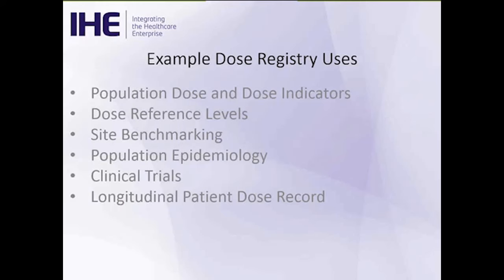So hot lab managers have been recording patient dose for a number of years, but that information has always been contained in the hot lab, and the REM-NM profile now allows that information to be viewed throughout the enterprise.